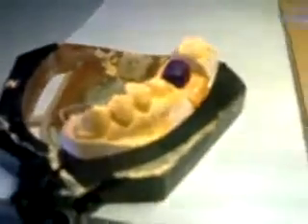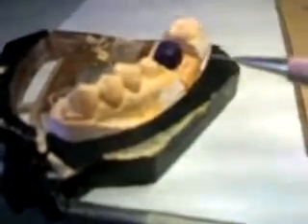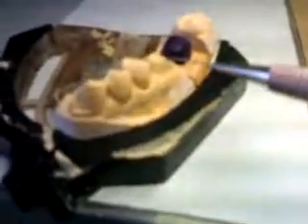The next step will be skinning off most of the wax to make it most similar to this core right here, and then we can proceed with the spruing.